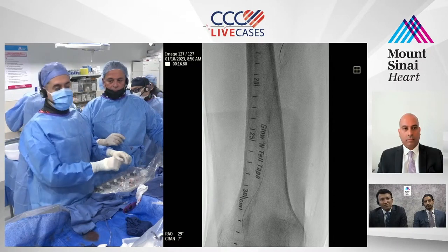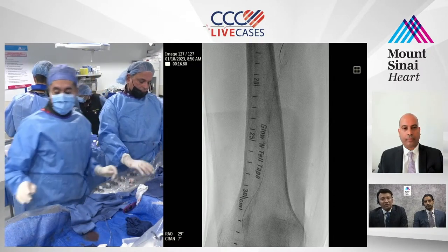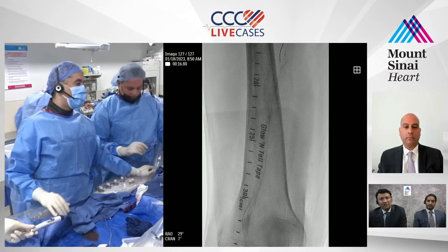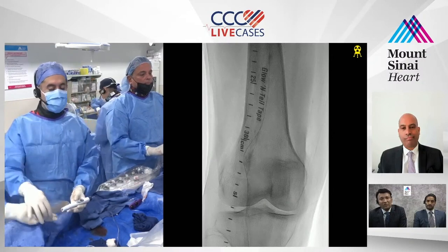Yeah, like to go through the bends. I'm not talking about the size of the device. I feel like Pioneer actually makes bends much easier than Outback does. We could try the Pioneer. We have that too. Yeah. No, I think Srini and Ajit, what do you guys think? Okay. Srini, what do you think?